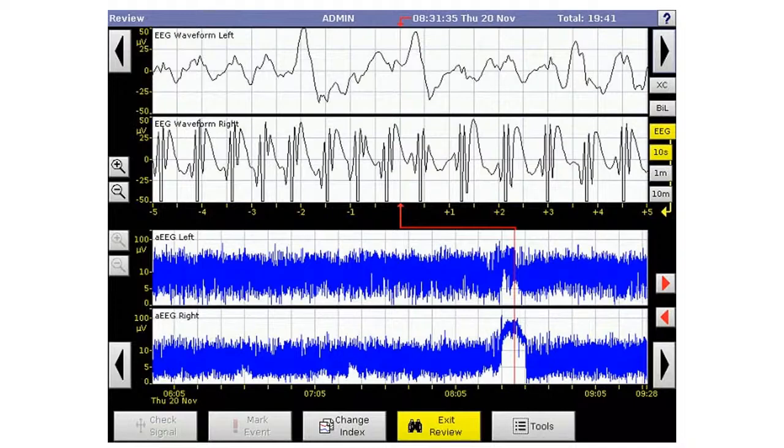We can see here in this snapshot, this pattern is repetitive for the entire 10 seconds. The other way to think about it is if I scroll this to the right or to the left, can I pretty much predict what I'm going to see? That's another indication of rhythmicity, when you can predict what you're going to see next.